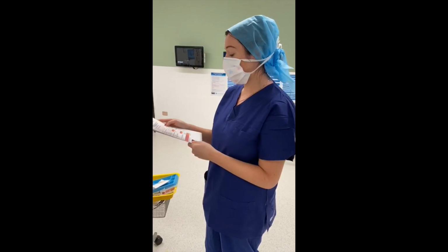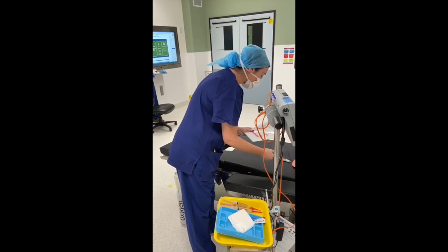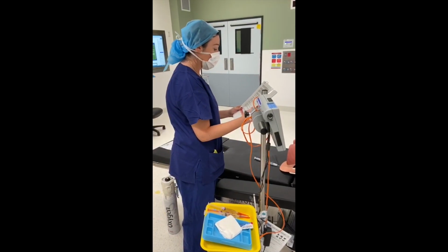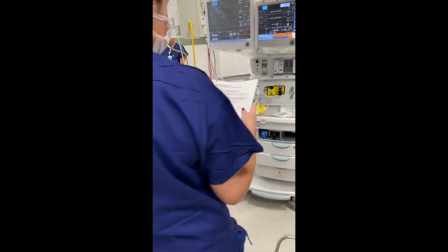The anaesthetic doctor will connect the ET tube to the circuit and announce the circuit is connected. Okay, pre-oxygenation is now complete and we'll commence the DOVES sequence. I'm giving fentanyl, ketamine and suxamethonium. Fasciculations are present. I'm giving rocuronium. I'm now walking to the anaesthetic machine. Please keep your mask in place.